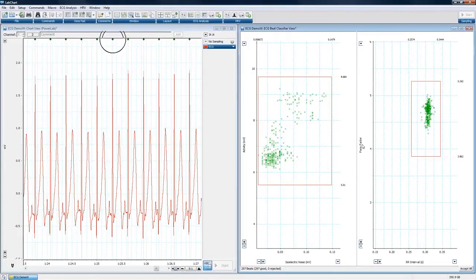Okay, we're recording from this rabbit, but it is not showing. It's not conforming to a known good rabbit ECG form for lead one. It's looking a little off from it.